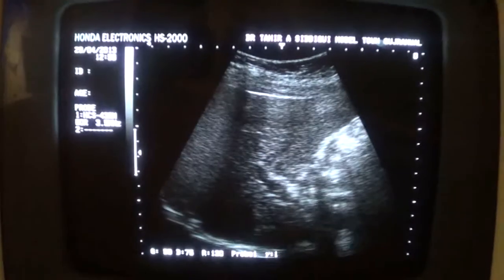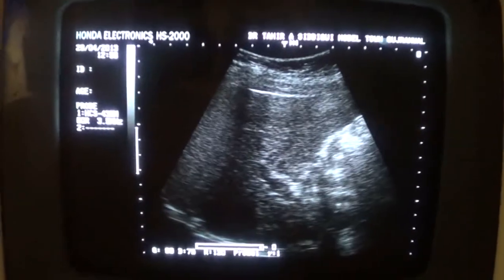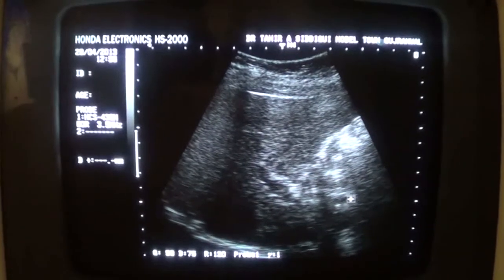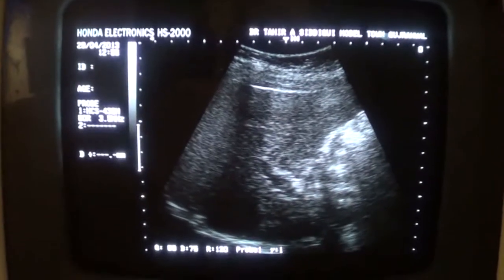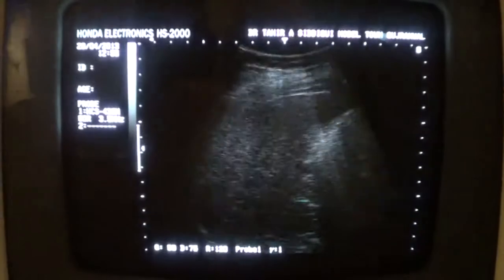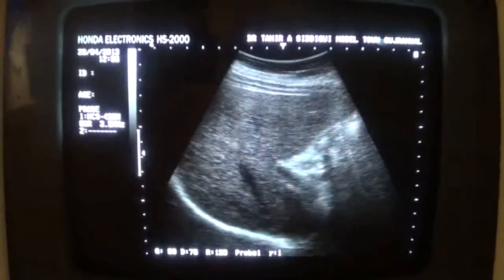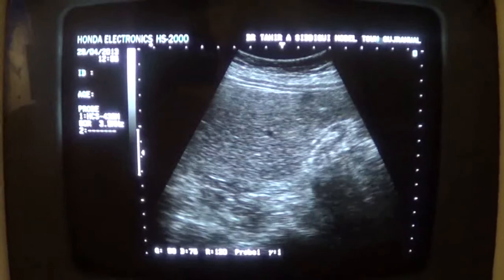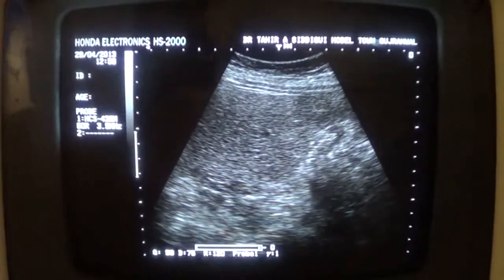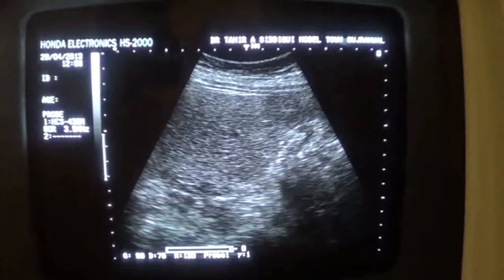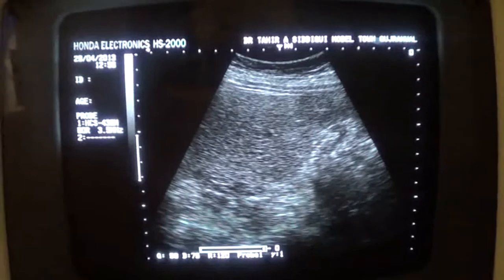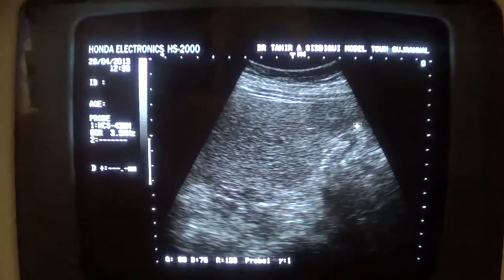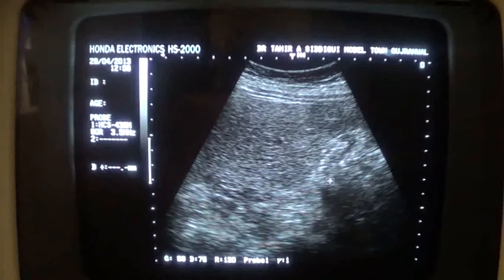Here we can see the common bile duct. This is the common bile duct, and this is the portal vein. So here we see again that this is the case of a contracted gallbladder with the lumen filled with calculi. This is the gallbladder. Thank you very much.